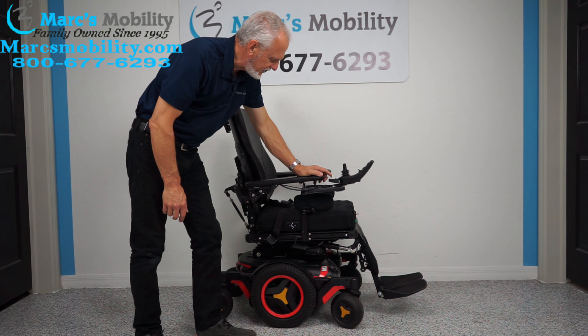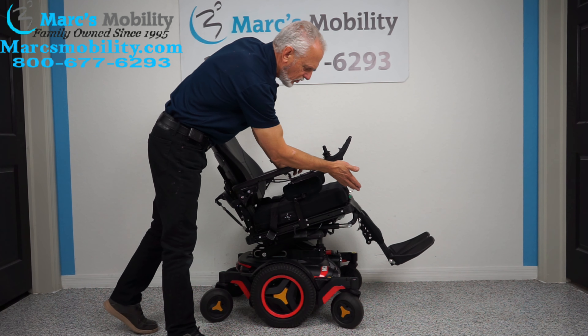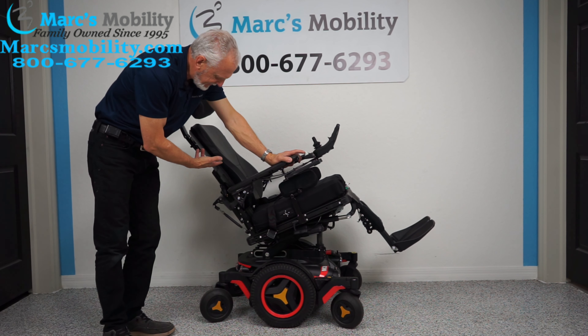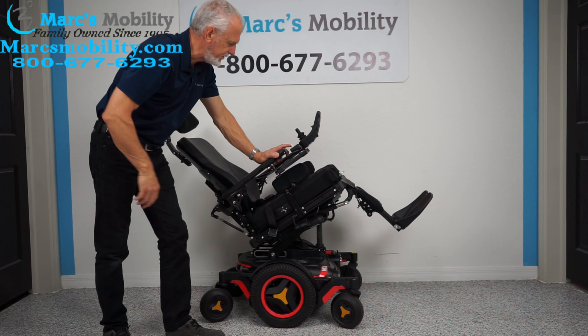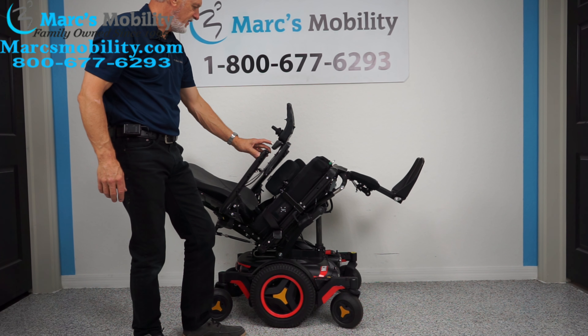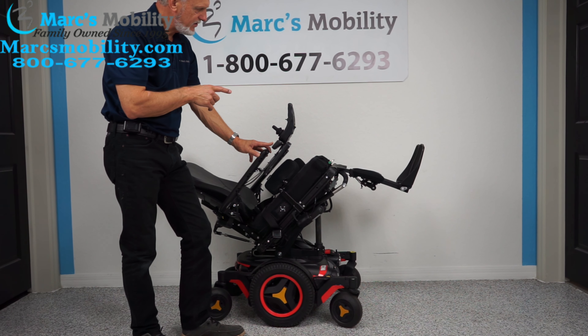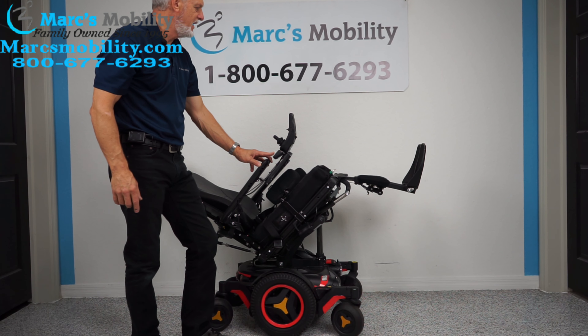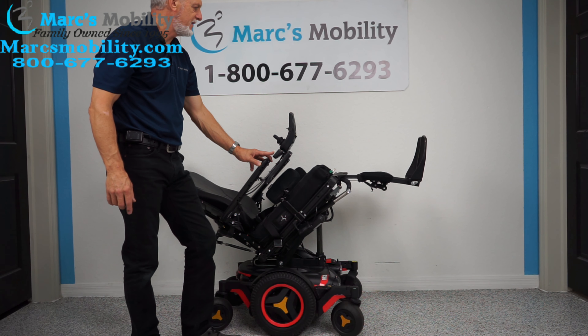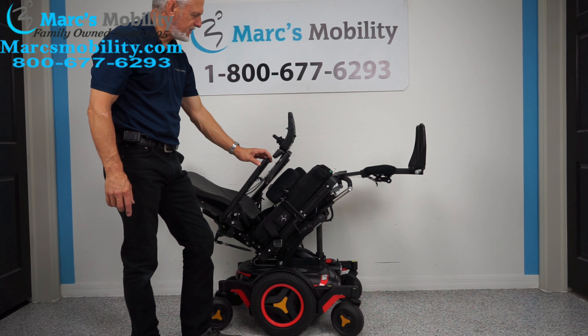The next feature is called the electric tilt. The electric tilt is when the base tilts back, and it takes the legs and back with it since they're all connected. This is as far back as it would tilt. These are electric legs as well, so for good circulation you can tilt the seat back and move your legs up to have your feet higher than your body.